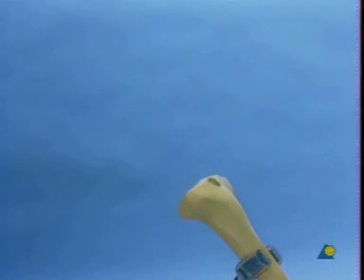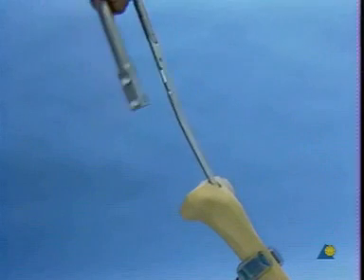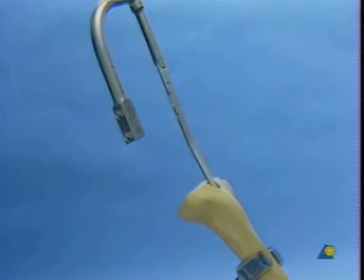The unreamed tibial nail is introduced as far as possible by hand. Lateral positioning of the insertion handle facilitates the introduction of the intramedullary nail. In contrast to the situation in the clinic, a few light blows with the slotted hammer may be needed to insert the nail into the artificial bone.